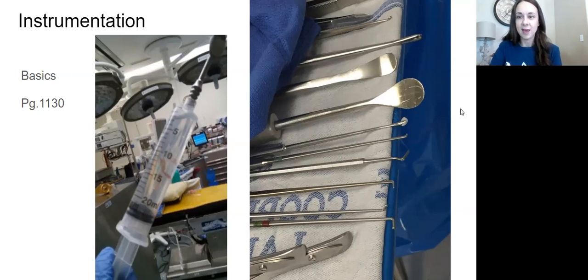After that is aneurysm clips, and I'll talk about that when we get to aneurysms. What you need to add to that is what's in your orange book. So there are temporary and permanent clips, and there's a different handle, a plier, for both of those. I will tell you, when it comes to loading these, it's kind of like heart surgery, like those Castroviejo needle drivers. They've got a little attachment in the center, so you have to pick it up and clamp that aneurysm clip on there just right so it clicks in the middle when you hand it over. So it's hard to explain through video without holding it in your hands, but the name of the game is definitely finesse and being very gentle and calm.